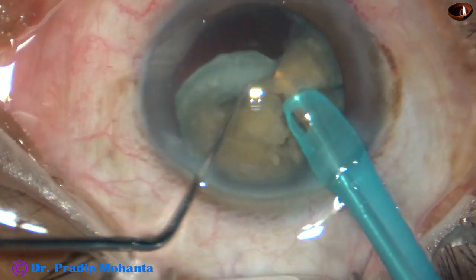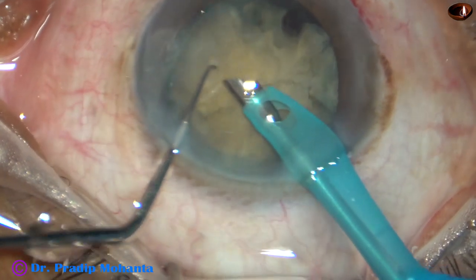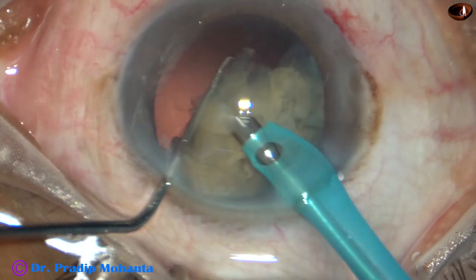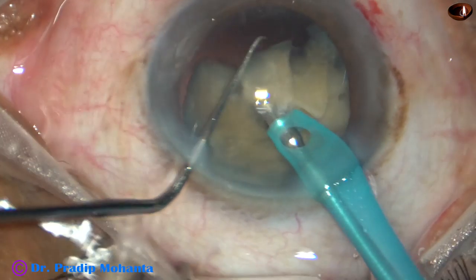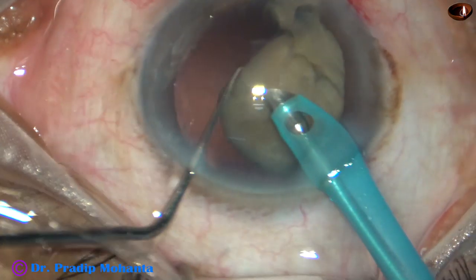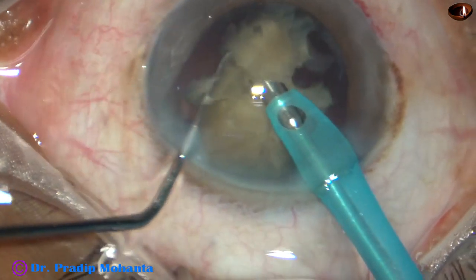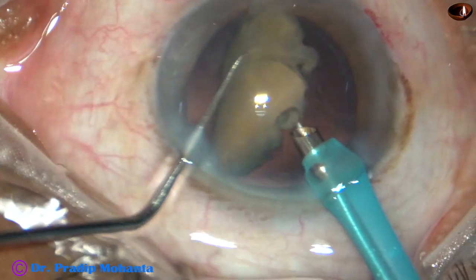The equatorial part is being emulsified, tilting the nucleus to some extent. After tilting it up to a certain point, I had an idea — I wanted to flip this nucleus.